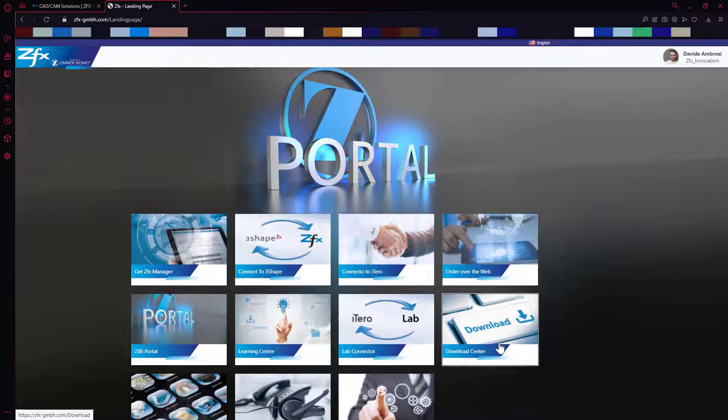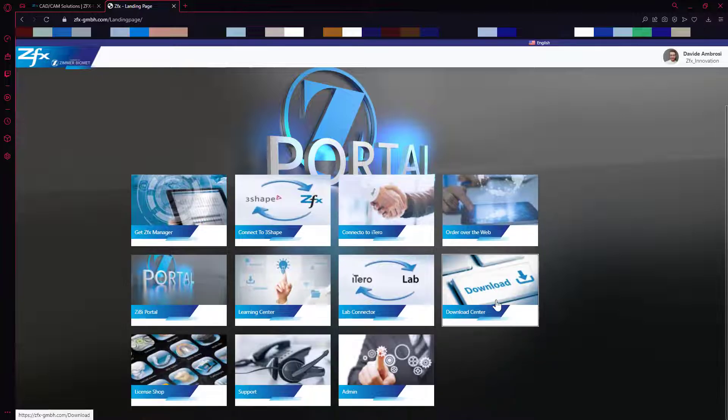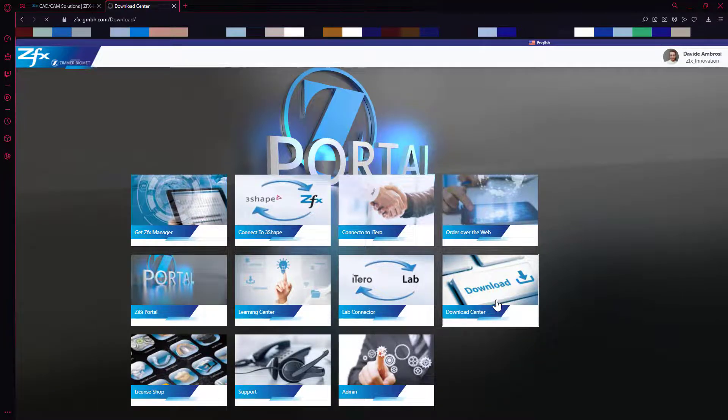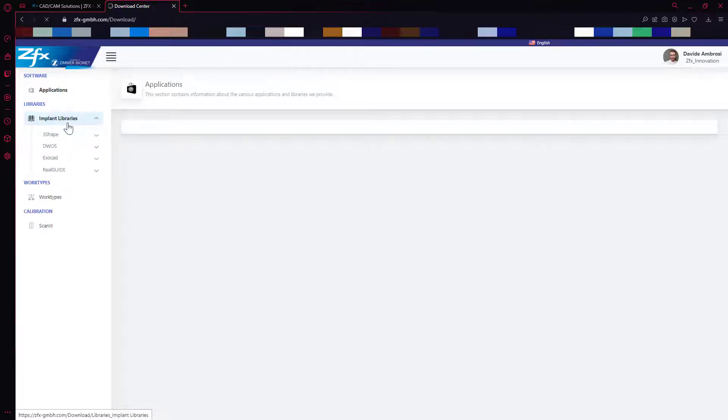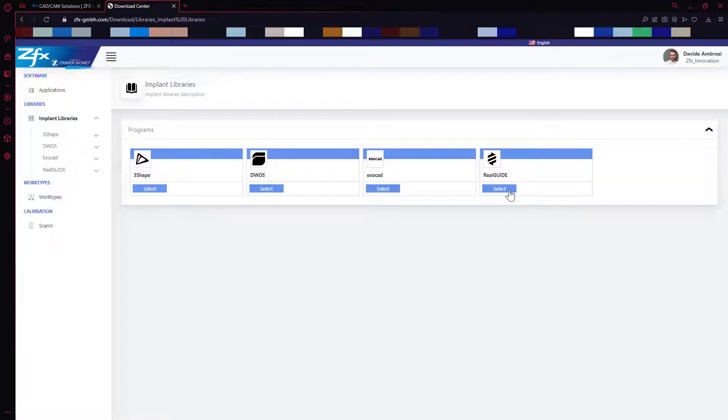Now go to Download Center and to Implant Library section. Select RealGuide.